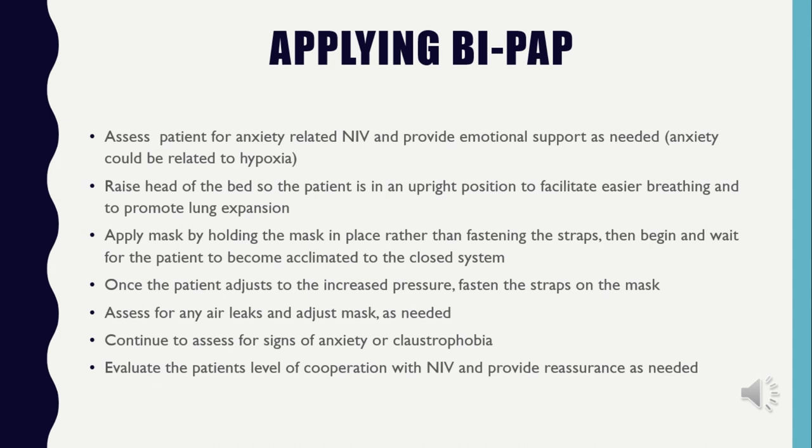Also, you want to assess for any air leaks. Sometimes these patients might have an NG tube in place, or you want to make sure that they do have their dentures in as well to provide the full seal with their mouth. Also, you want to continue to assess for anxiety, claustrophobia, and offer emotional support throughout the whole treatment. And you always want to evaluate and intervene and notify physician if the BiPAP machine is not helping them.